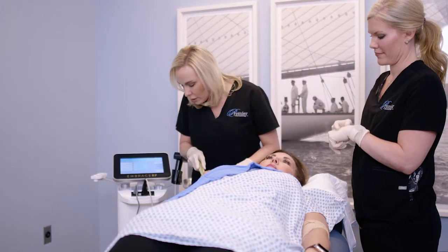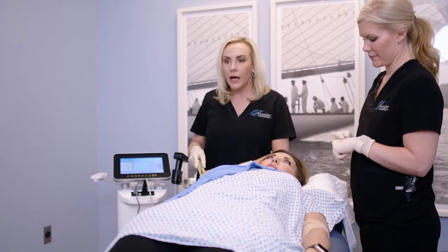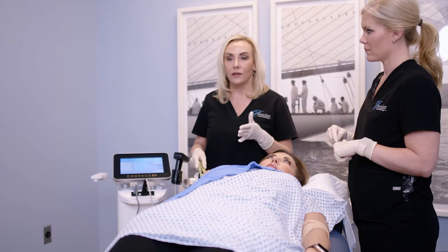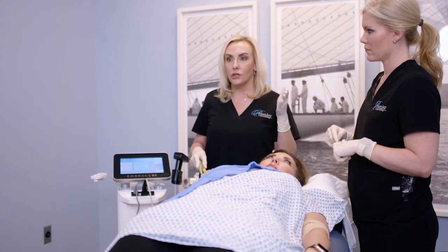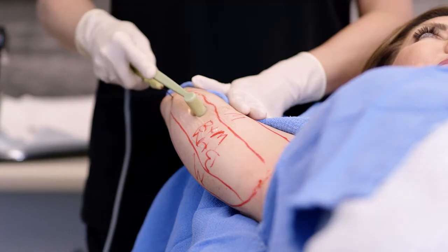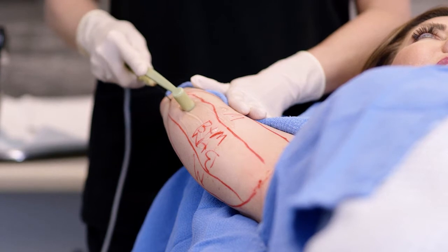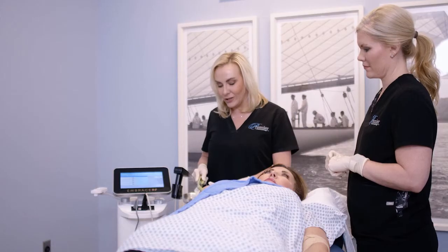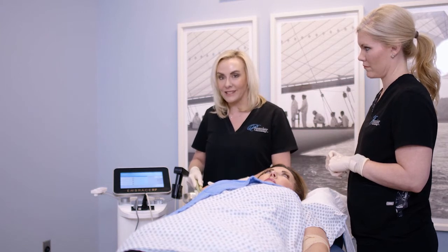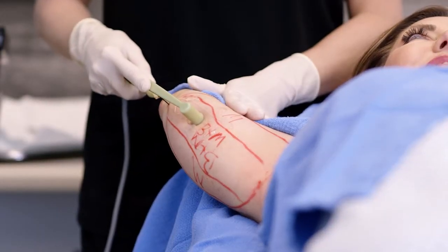All right, so we're going to go, and you can actually see the machine as we go, and you'll hear a series of beeps. It's pretty loud. When we get to a place where it goes ding, ding, ding, ding, ding, that means we've hit the magic number where we've gotten both the internal and the external temperature at the right place. You may not be able to hear that, but Sherry probably did. It almost sounds like popcorn crackling, and that is the heat energy being delivered into the fat tissue there. And it almost makes a popping sound because it's melting the fat. So when we hear that, we're excited. It means it's working well.